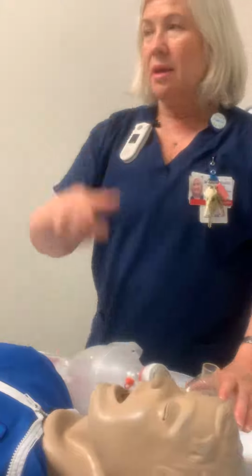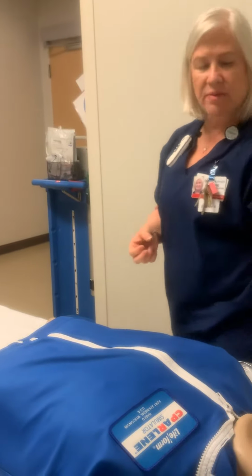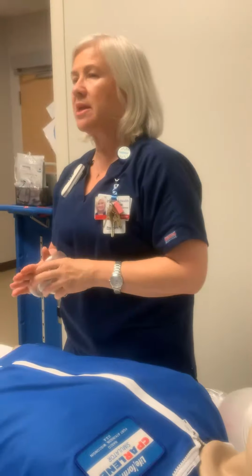So if we don't have a pediatric one, since we don't know peds over here, what do we use? You always have to use the peds one here. It used to be that all the ambu bags had both in there. I don't think that's true anymore. Yeah, I think they took those out. Okay, so I think we need to get one over here, because you have to get a pediatric one. You can't use an adult. If you try to use an adult on me, there's just no way you're going to get a good seal. So you have to have a pediatric.